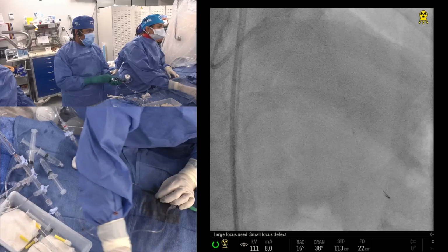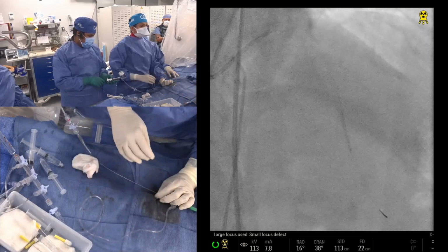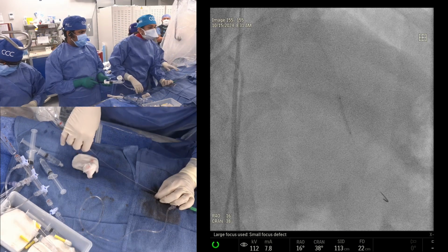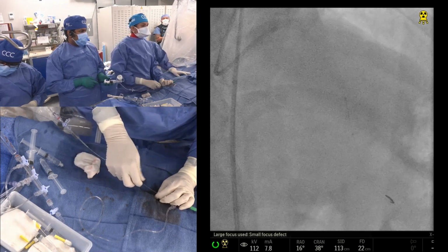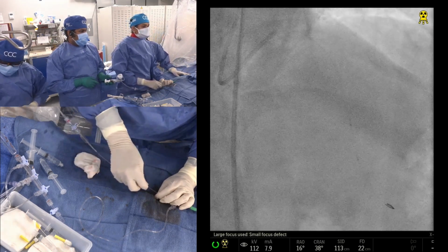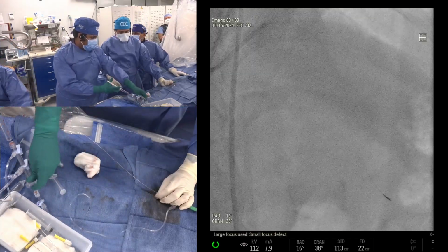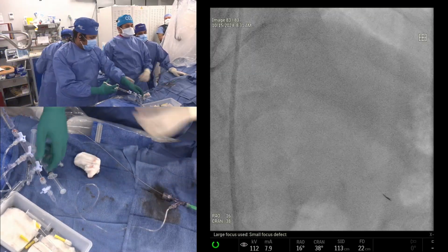And this is kind of the case people are doing nowadays. You have all the diffuse disease, you just leave it with a drug-coated balloon. Ours is a trouble because it's a very expensive strategy. If you had to put in two drug-coated balloons, you're 10,000 down. The hospital had to apply for some loan. Done? You want more pictures? No, we have to decide now.